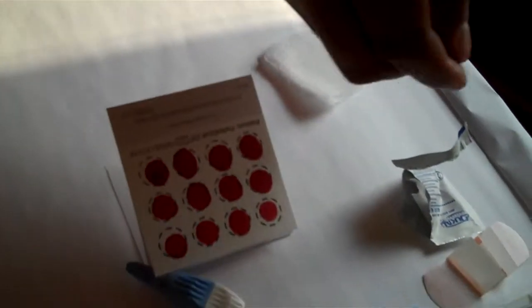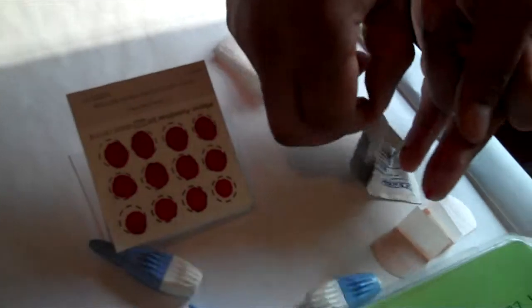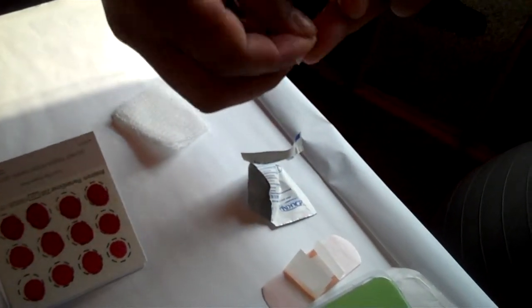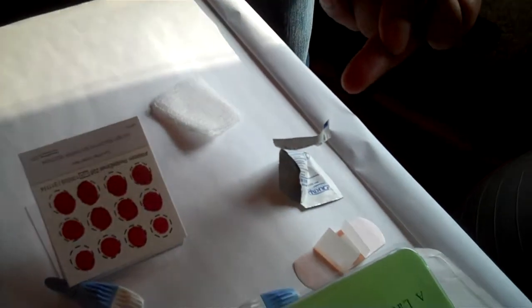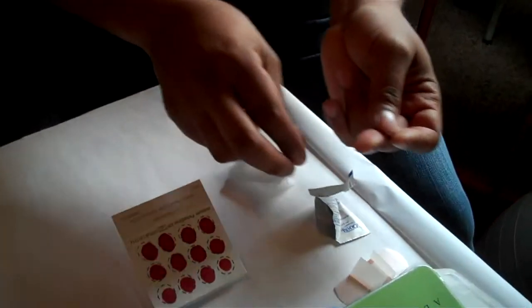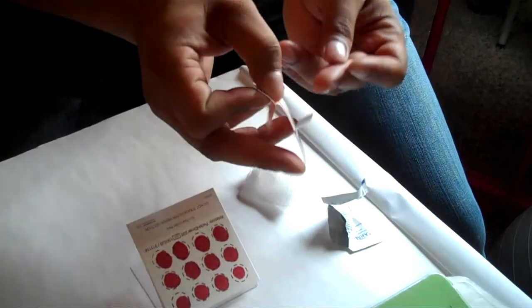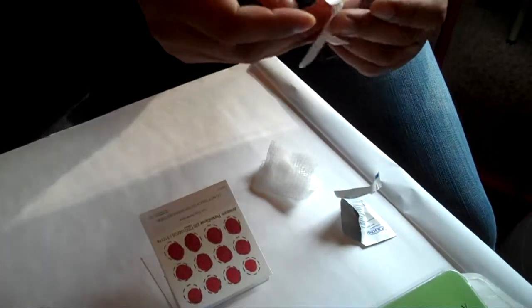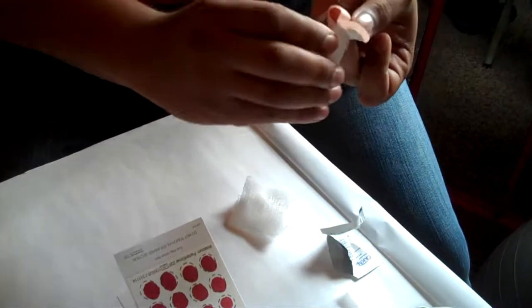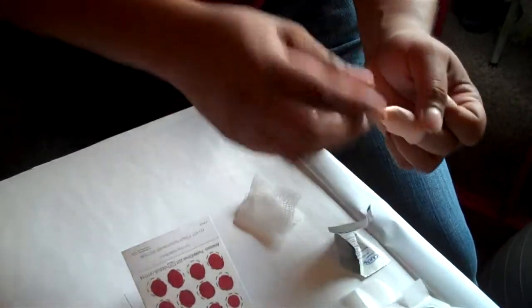Go ahead and do that, and one more — voila, we're done. Take your alcohol pad, give it a wipe, then take your gauze and hold it on there for a minute. Usually when you get the blood running really good it's going to keep coming out, so that's what your band-aid is for — wrap it up nice and tight.